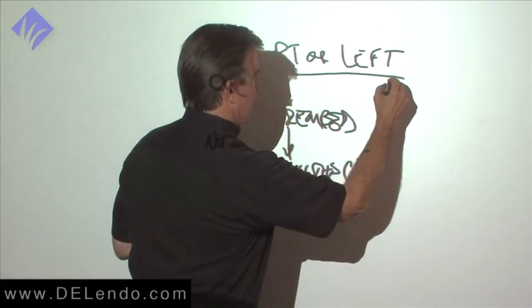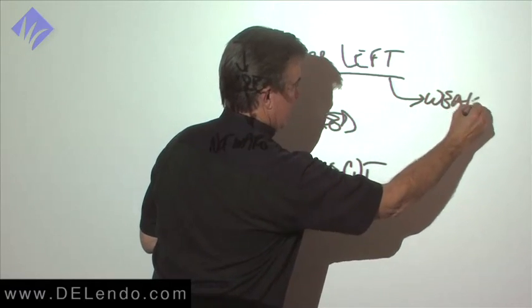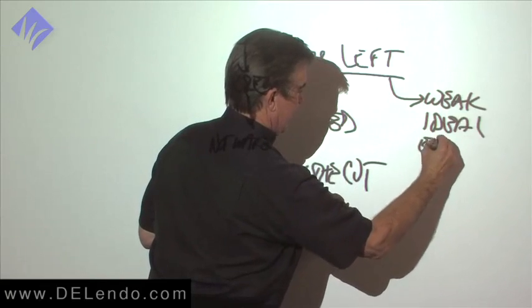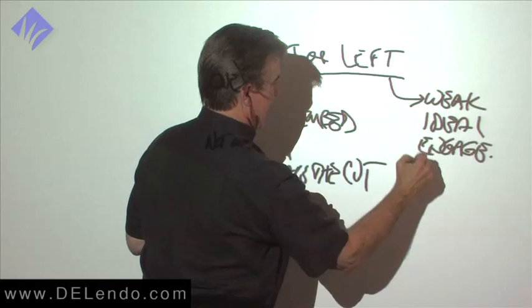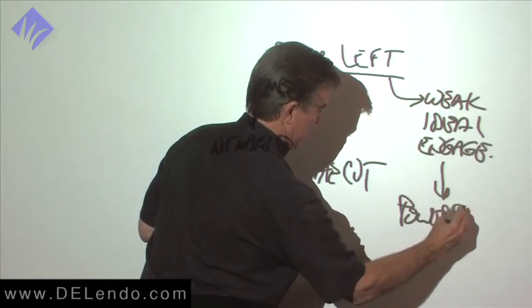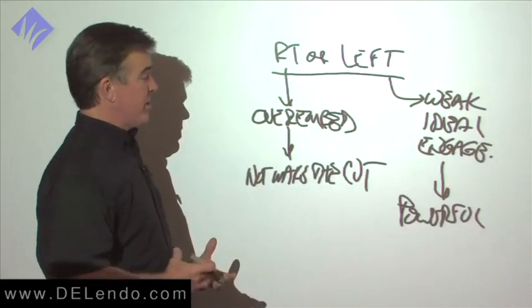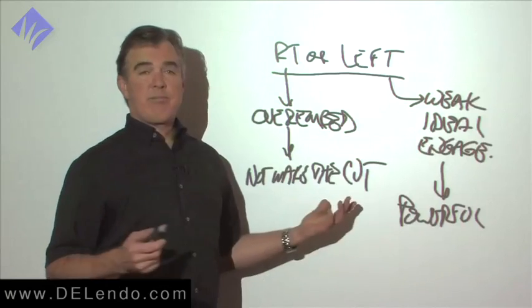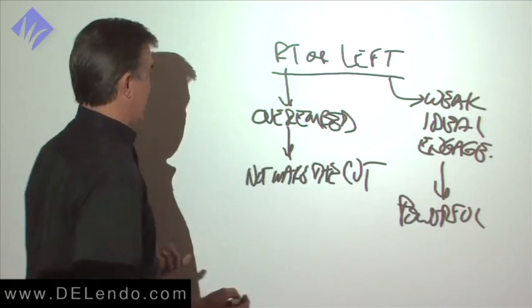Left-handers, it works great because they have a weak but ideal engagement stroke, and they have a powerful counterclockwise cutting stroke with a conventionally cut file. This is a payback for all the problems left-handers have with normal scissors, I guess.